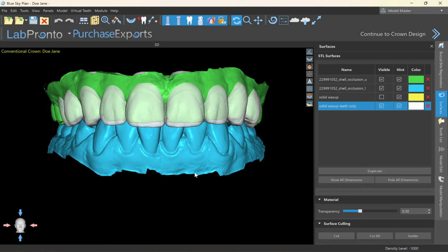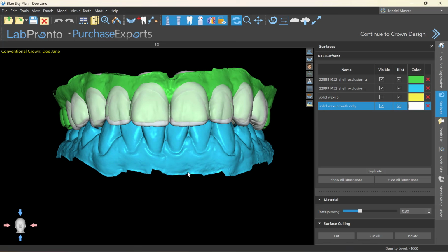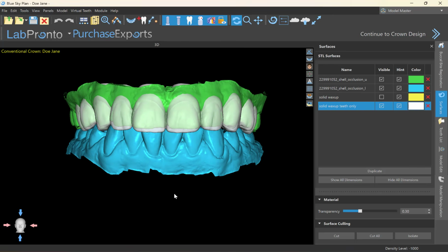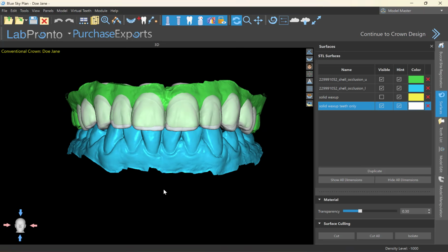All right, so I can think of at least 5 different ways off the top of my head how you could do a gingivectomy guide or a bone contouring guide. Definitely some of these would be sexier than others, and you could print the whole thing. But I'm not going to show that because I really don't think it's the most efficient, and I really don't think it's the best. Okay, I know others have published that, but listen, when simple works, let's don't make it complicated. All right, so you've done your wax up.